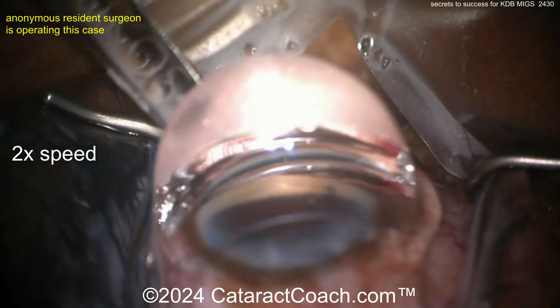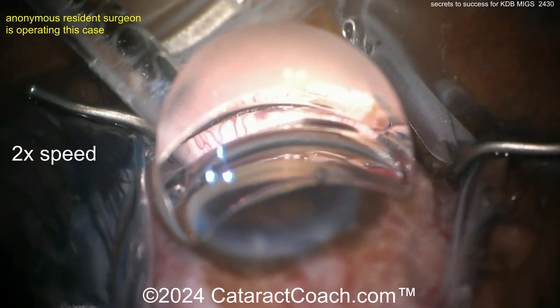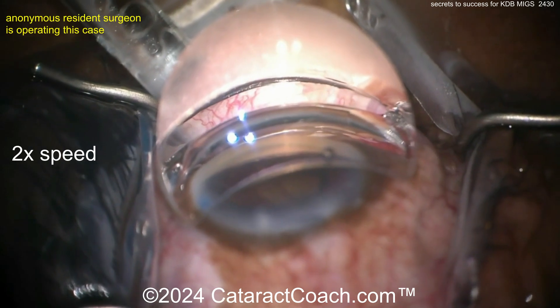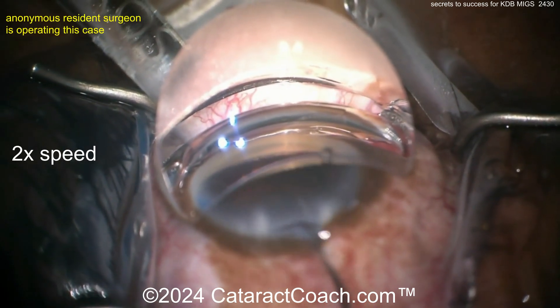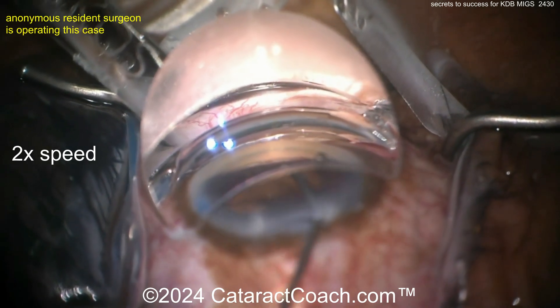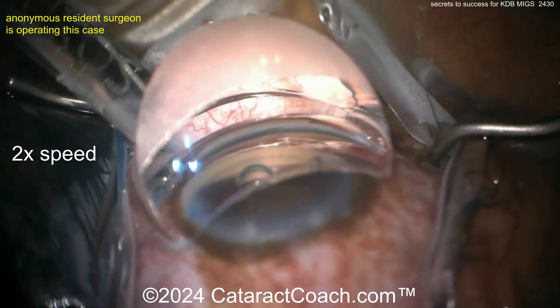Once that's done, you want to try to start a little bit more to your right and then go to the left, doing it all in one good sweeping motion. Some surgeons will do half one way, then reposition the blade and go half the other way — that may be reasonable as well.